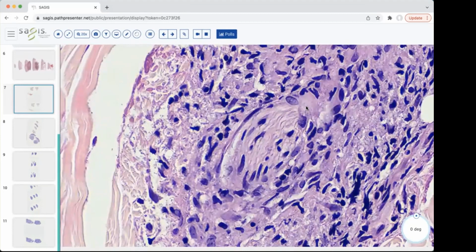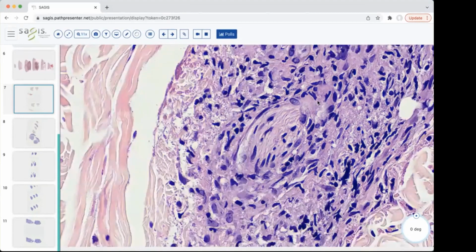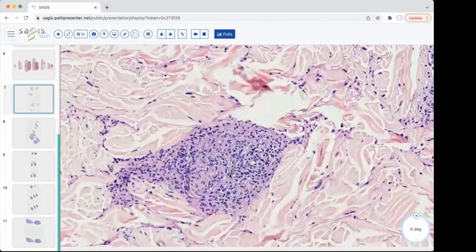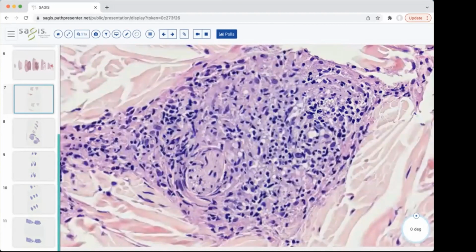So we have linear or curvilinear granulomas that are peppered with lymphocytes. And then there's this strong perineural predominance. And we can find that in other areas as well. I'll let that focus in for just a second. But again, a collection of histiocytes that's perineural here. This is another nerve sort of cut in cross section coming out at us.